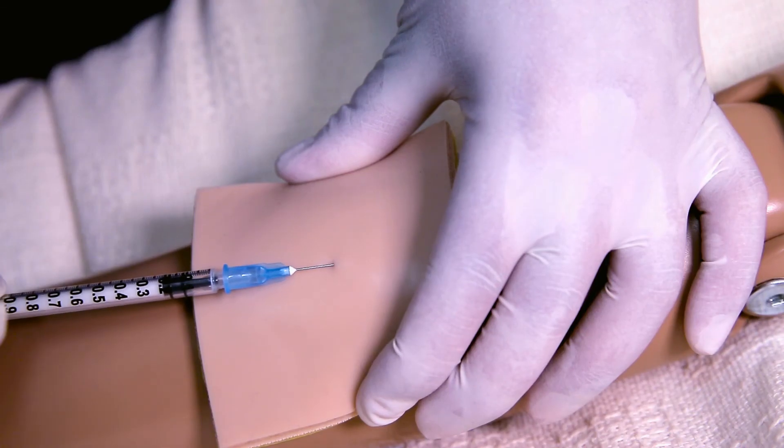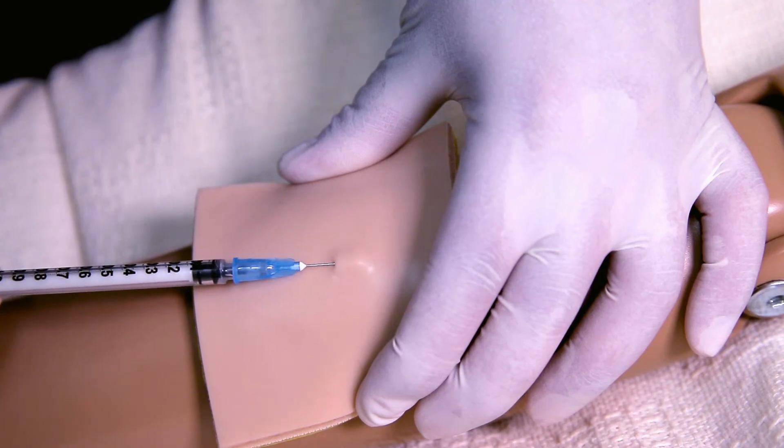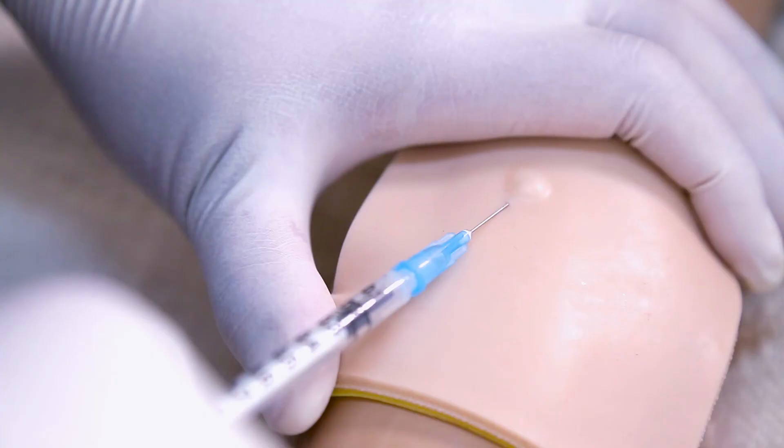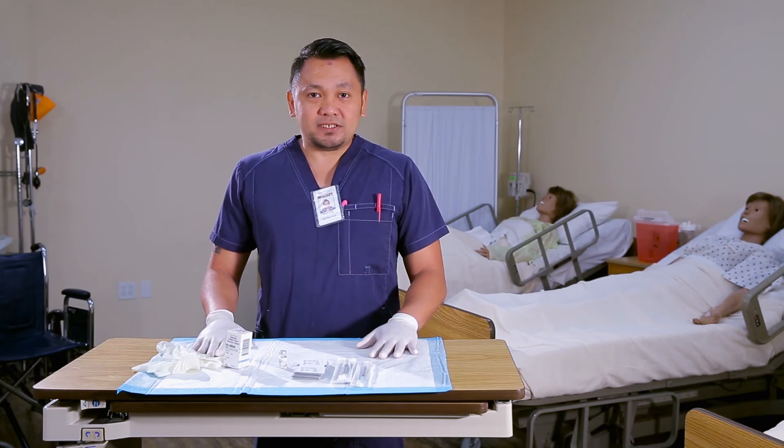Slowly inject the medication and notice the small bleb form under the skin surface. Withdraw the needle and apply gentle pressure with an alcohol pad. Do not massage the injection site.